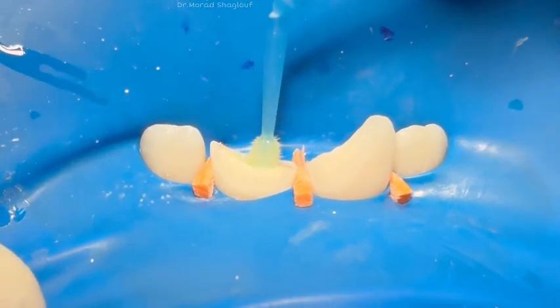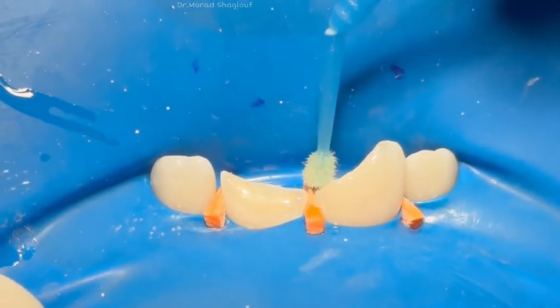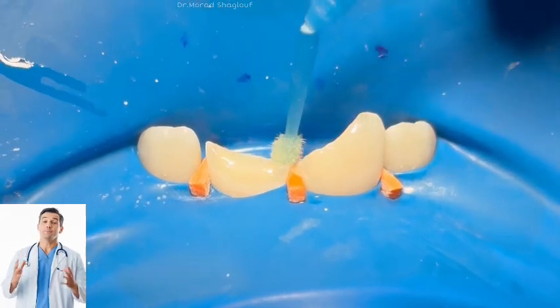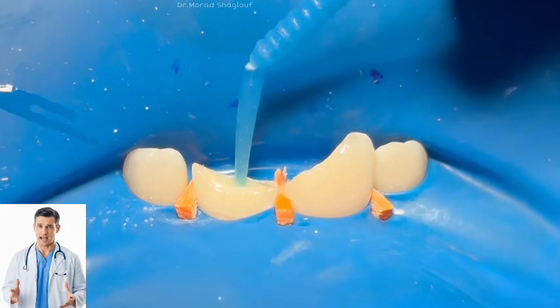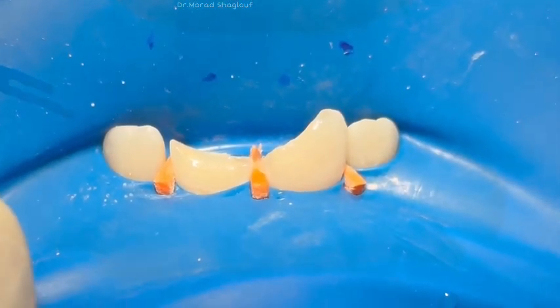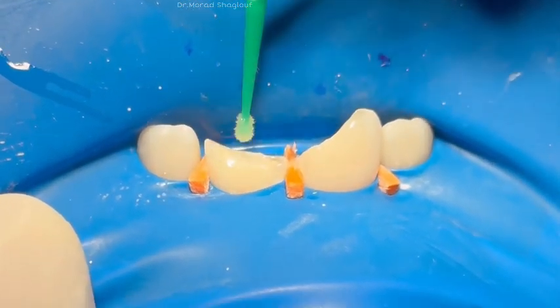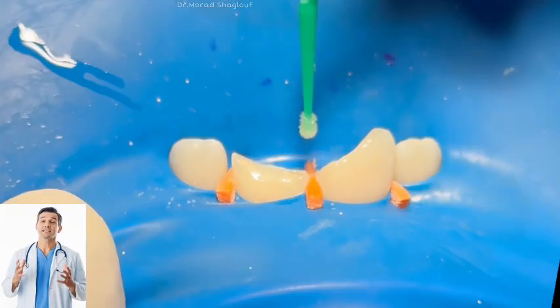With the post secured, the core buildup is performed. Composite material is layered carefully to recreate the natural form of the anterior tooth. Special attention is given to contour, alignment, and symmetry to achieve an aesthetic result. Throughout the procedure, precision and control are essential.